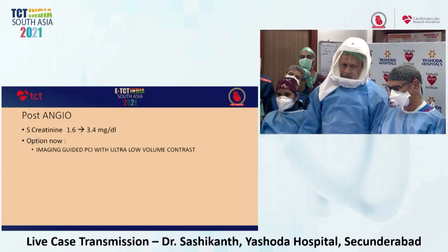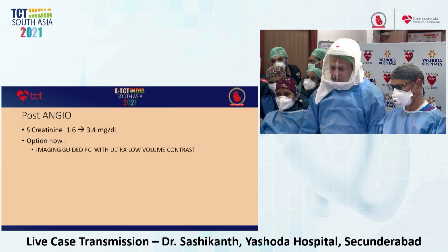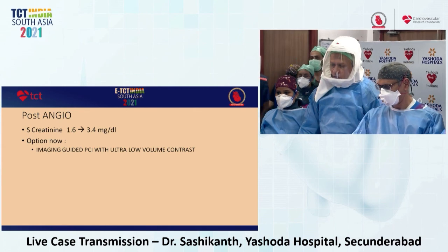The family was not willing for renal replacement therapy. The family was not willing for bypass surgery. So we had the option of doing an image-guided PCI with an ultra-low volume of contrast.